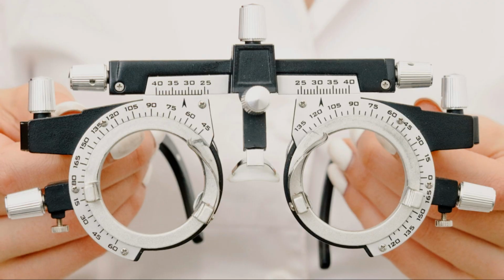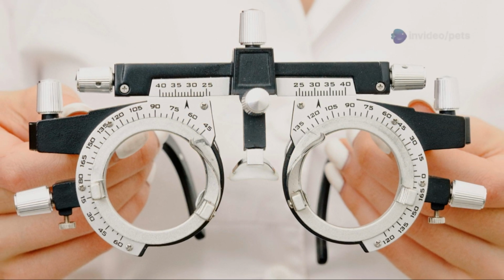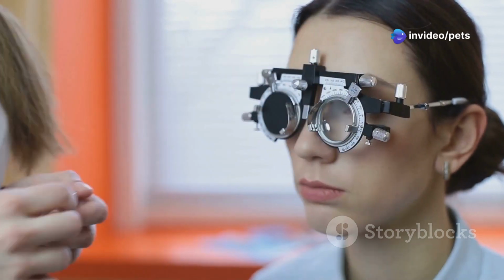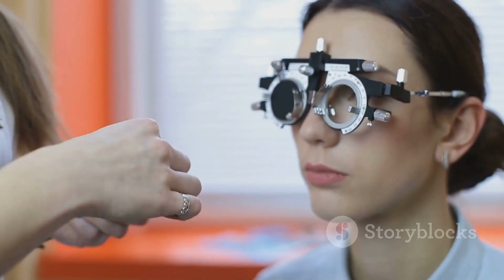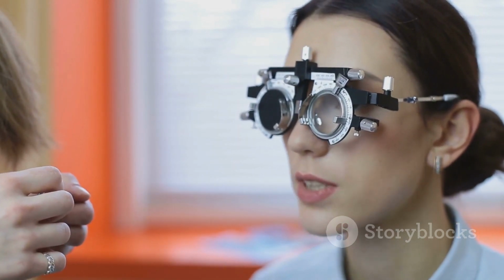target. The optometrist uses an instrument called a retinoscope, which projects a streak of light into the patient's eye. By adjusting the lenses within the retinoscope, the optometrist aims to neutralize the movement of the retinal reflex, indicating that the light is being focused correctly on the retina.